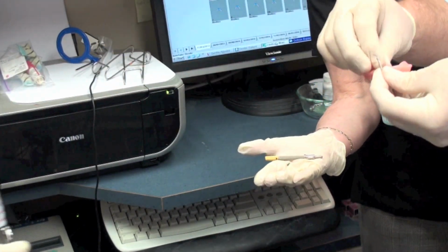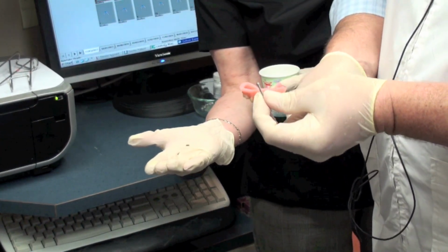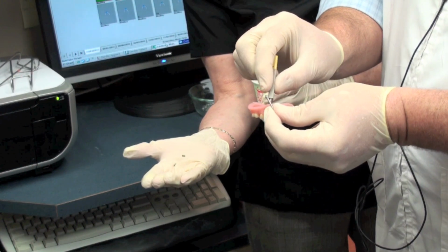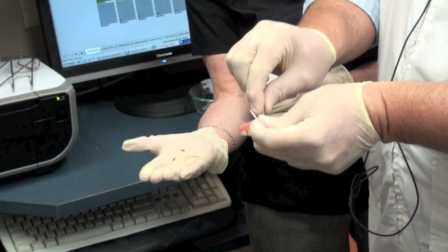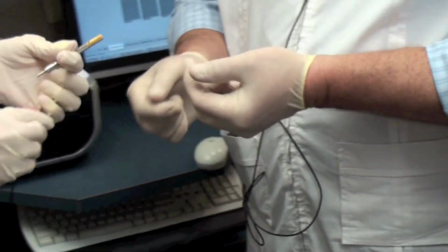But you saw when I first went to the patient, it was not staying down at all. And so it's critical to have it stay down. So these were blue, and the blue often turns green. Actually, why don't you put the blue ones in for us? Okay. So we're going to put this back in now. I'll give this to you, so I'll just lay the blue down and snap them in place.